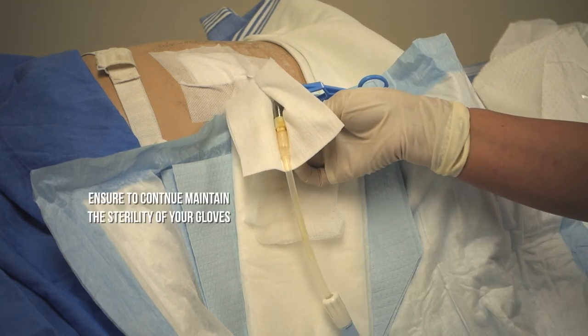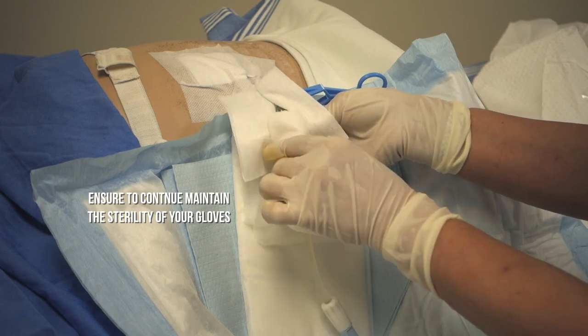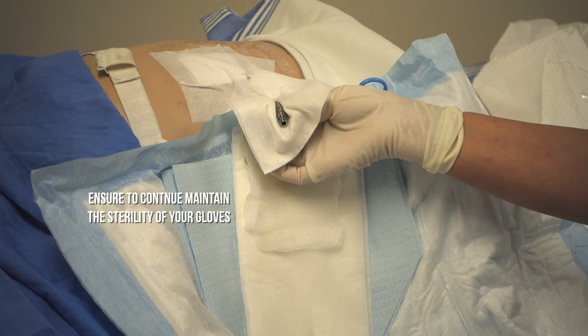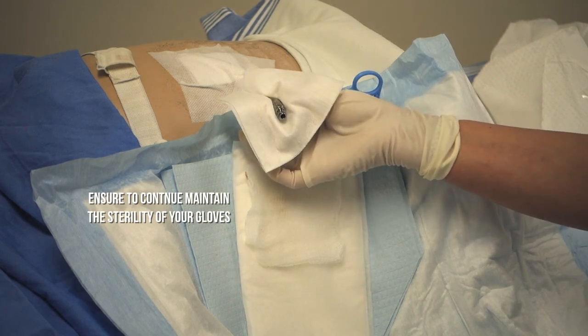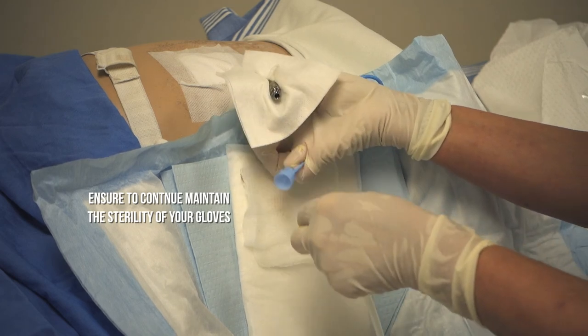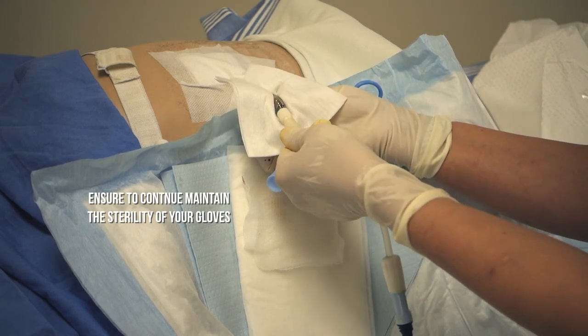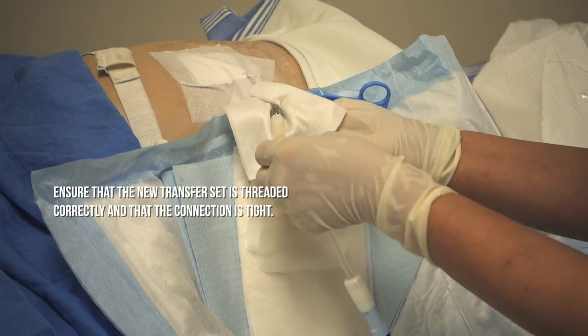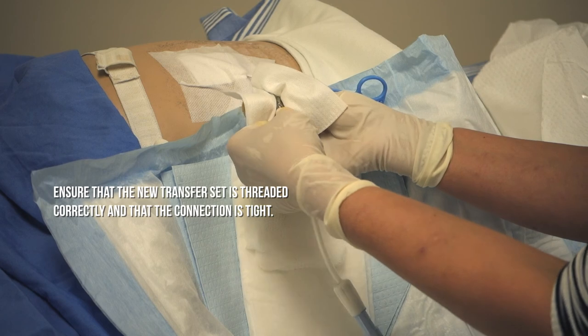Then you will take a sterile gauze and remove the old transfer set. Then you will take the new transfer set, remove the sterility cover, and thread the new transfer set onto the titanium. Ensure that it is threaded correctly and that it is tight.